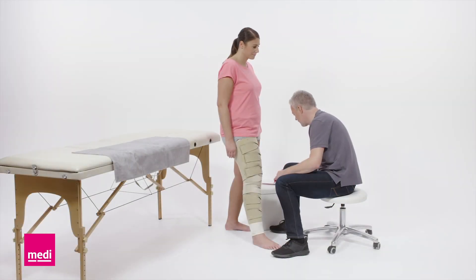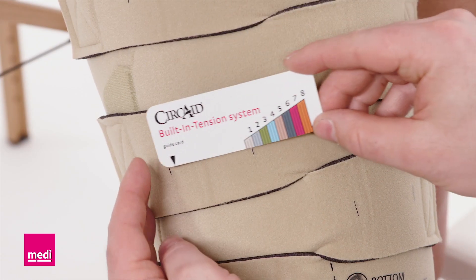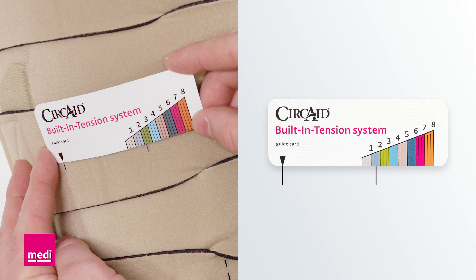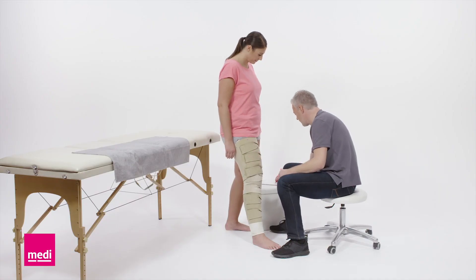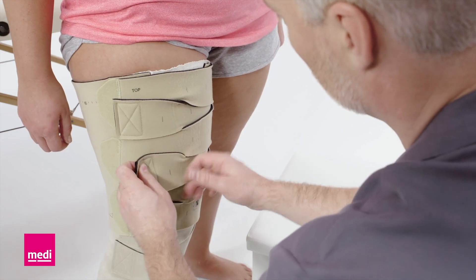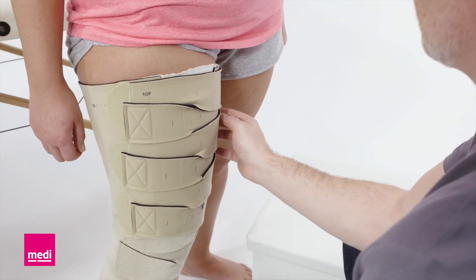The bands should be tightened with firm and comfortable tension. Use the provided card to identify the applied compression level. The distance between the lines on the band is equal to the compression pressure on the scale of the card. Write down the tension setting of each band to allow your patient to reapply the settings later.